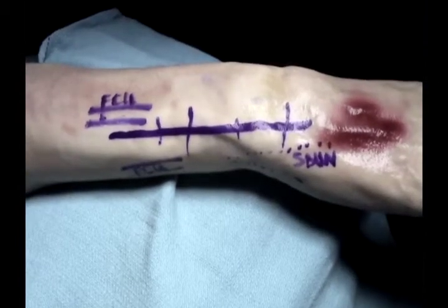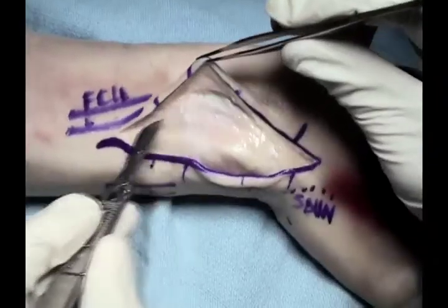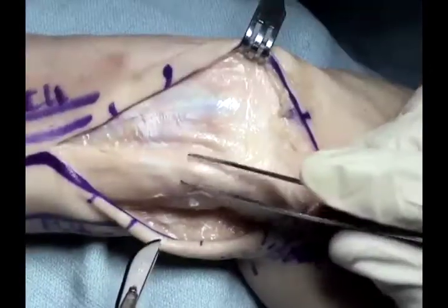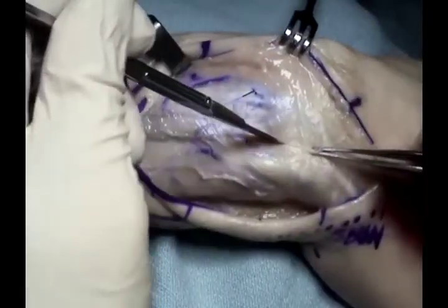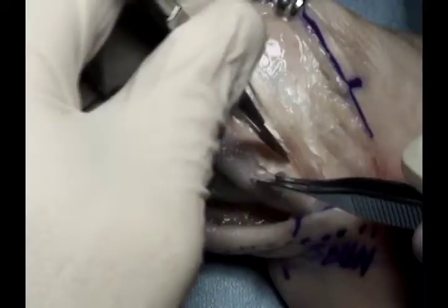It is key that the joint is fairly stable before considering arthroplasty. An approach can be used either centered over the ulna, or a more midline approach can be used as well. There are two options for exposing this. One is through the fifth compartment, with the release of the fifth compartment as shown here.